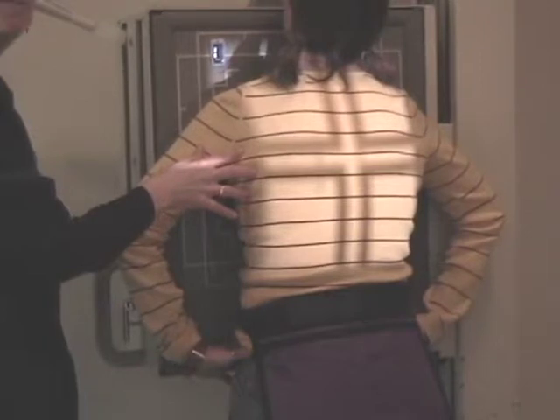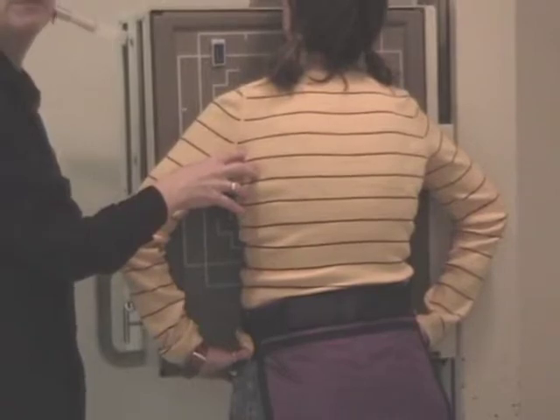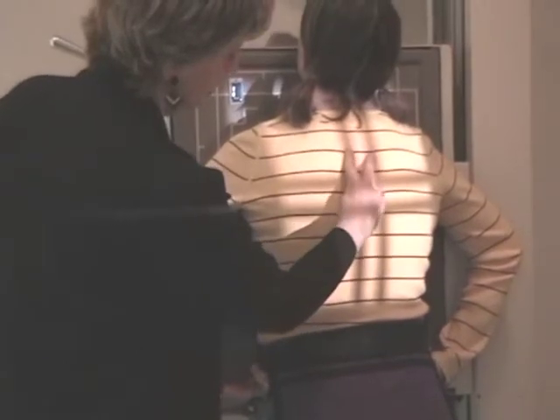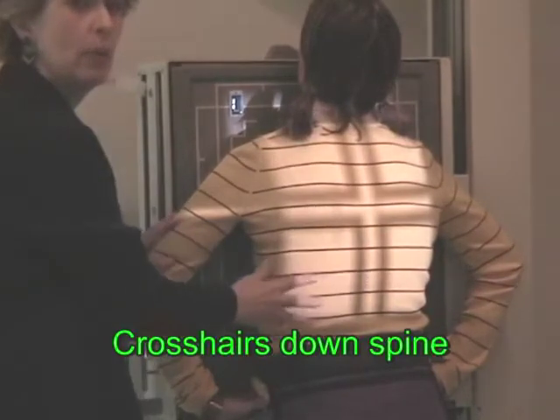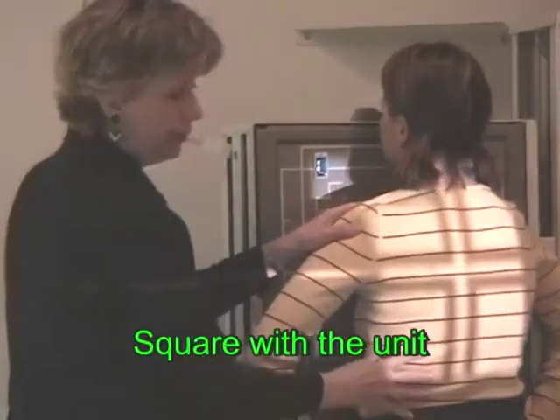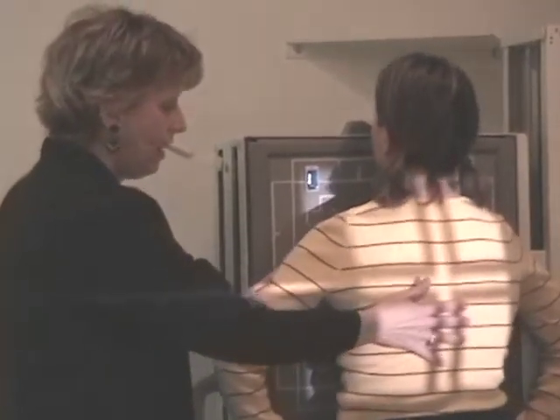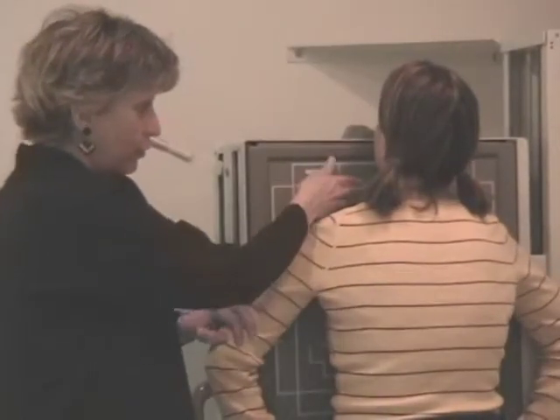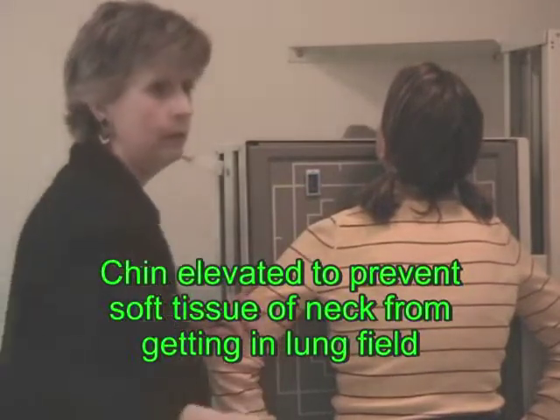And then I need to center the mid-sagittal plane to the center of the film. That's your vertebral column. And the trick there is to have this line come right down her spine. I can gently feel and see that this crosshair is coming right down the center of her spine. So I'm very happy with the centering. Now you need to make sure that the patient is square with the unit, that she's not turned. That's an oblique. This is not good to have. You need to have that lung square with your chin elevated to prevent the soft tissue of the neck from getting down into the lung fields. Okay.